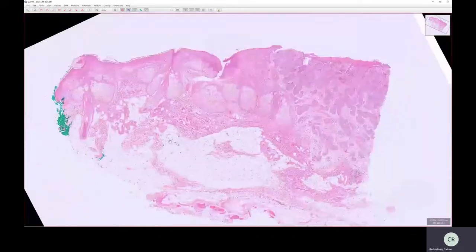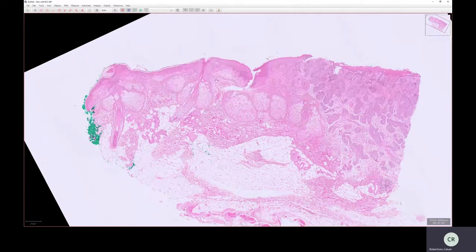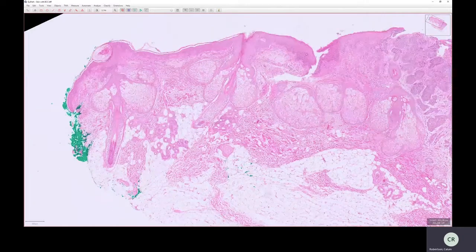So if we look around, I think we've identified all the tissue types here. There's probably one thing here that I've not talked about. This is not normal, so I'm ignoring this for now. This is all the normal stuff. This is skin. This is a basal cell carcinoma, and it looks quite different from this. I think this stuff is the normal stuff, and that stuff is the tumor. I'm ignoring that for now. But if we just look at this component, we've pretty much identified everything on the slide here.